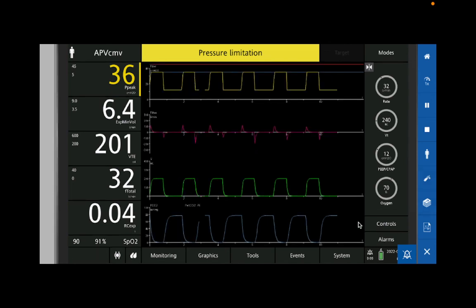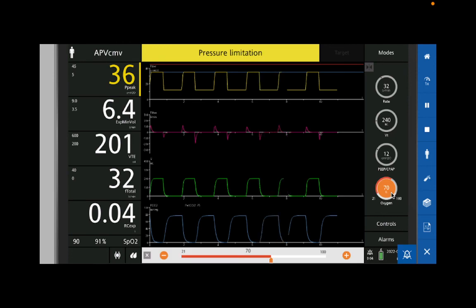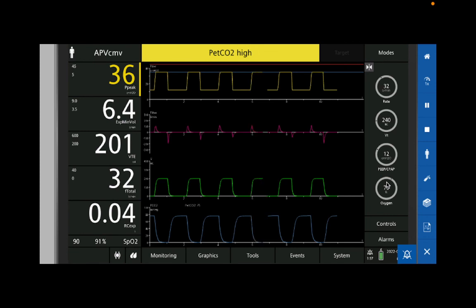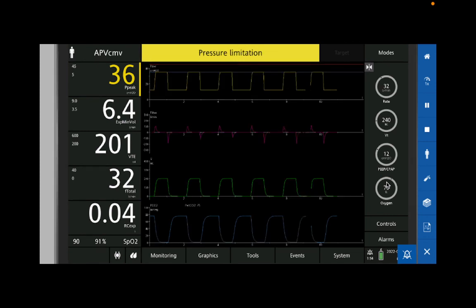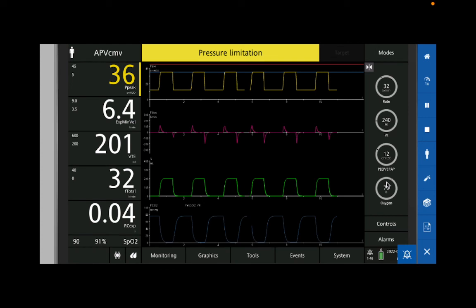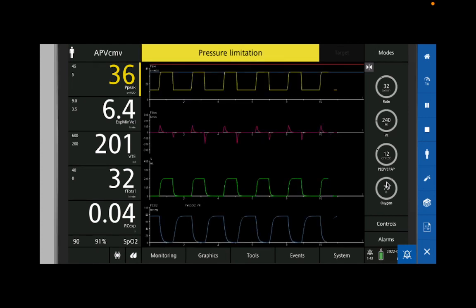So there's nothing wrong with increasing the FiO2 when your patient is acutely desatting, okay? Right now, our sats are 91. So in ARDS, in COVID patients, in patients with really bad lungs, we have moved the bar and said sats greater than 88 are okay. It's safer for the patient in the long run to let them sit 89, 90 than to be at high FiO2s for a long period of time.